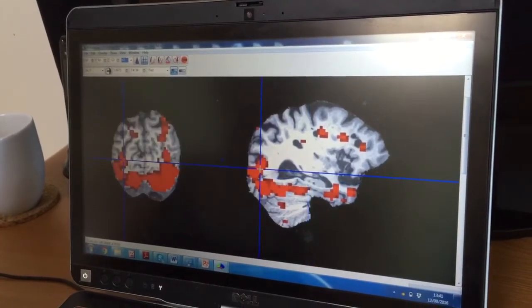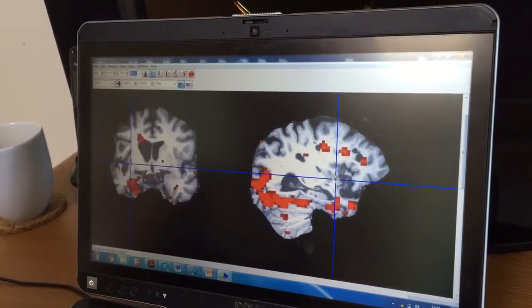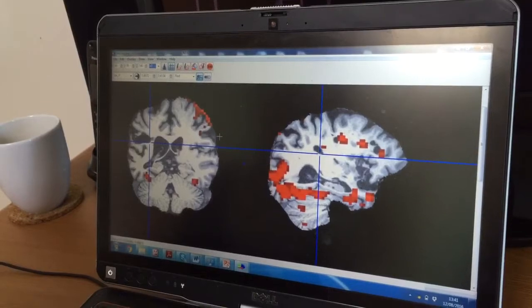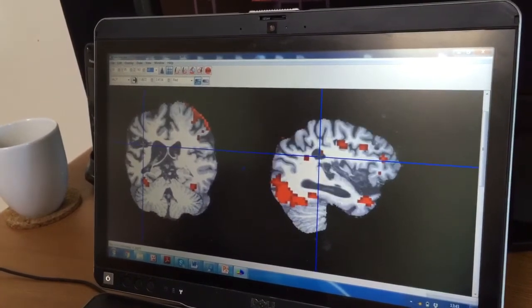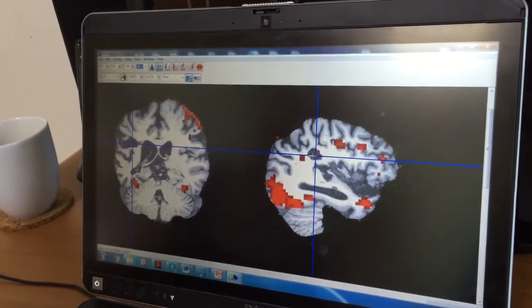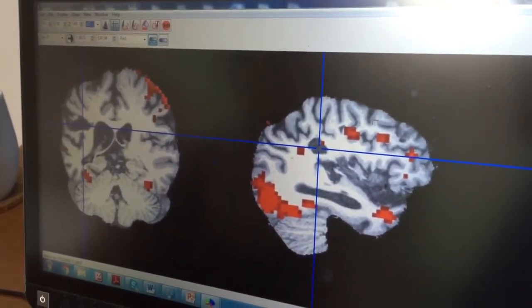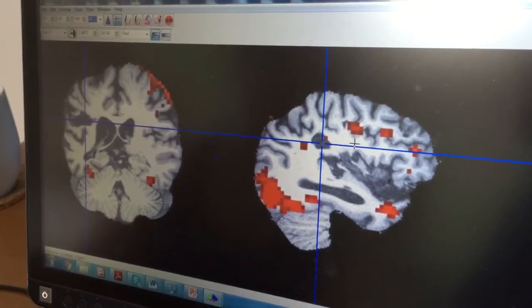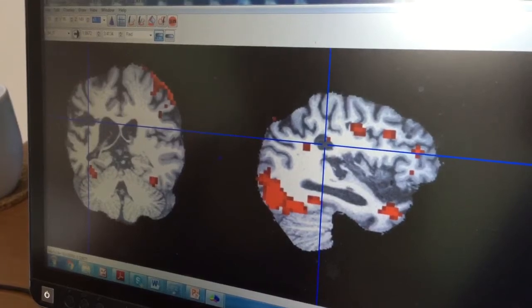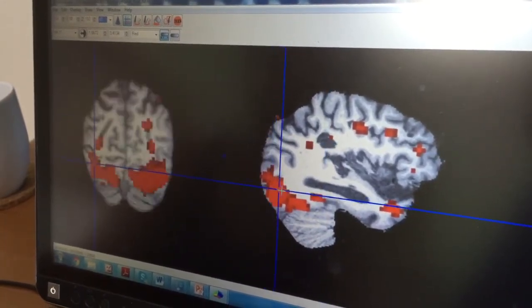Wow. I've not seen these data before, this is brand new. So here we go, this is your brain. You remember this here is part of your stroke. So you've got this really tough situation where you've blocked that pathway and that pathway, but actually the bits where you make speech are okay in terms of the structure, but you can't probably send the signals into it. Anyway, this is on your brain.